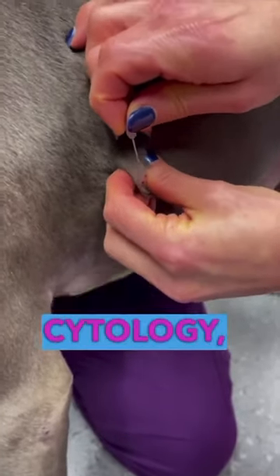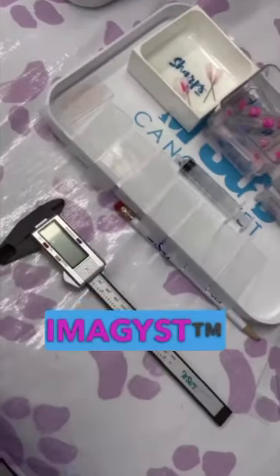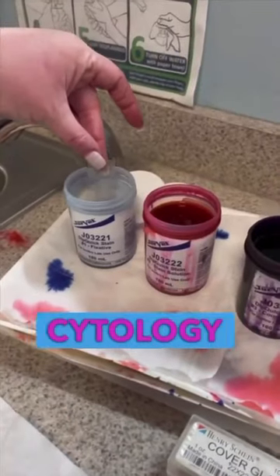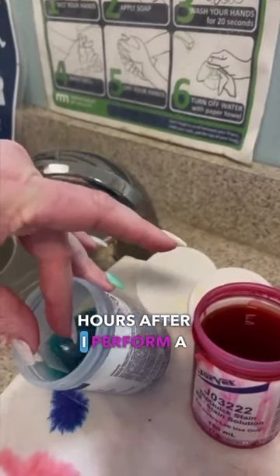If you have ever done an aspirate for cytology, you need to watch this video. I want you to know about the VetScan Imagyst from Zoetis. This digital cytology provides expert results within hours. After I perform a fine needle aspirate, we're going to prepare the slide.